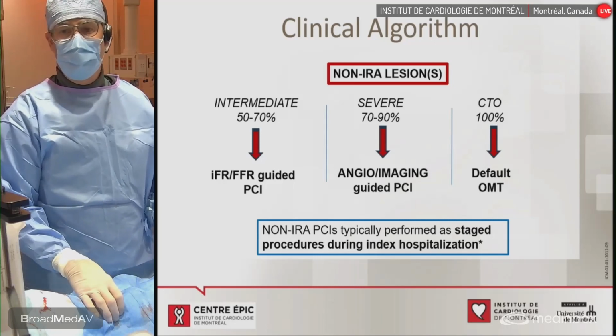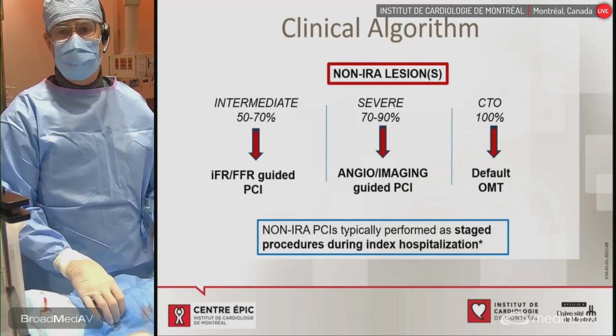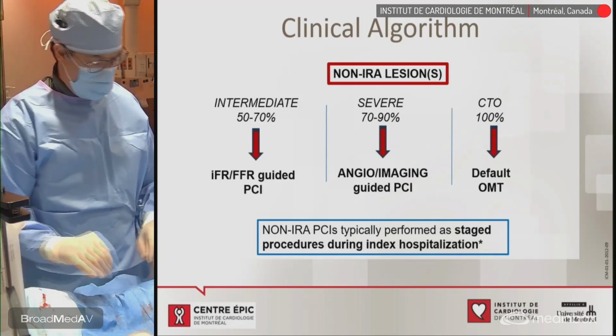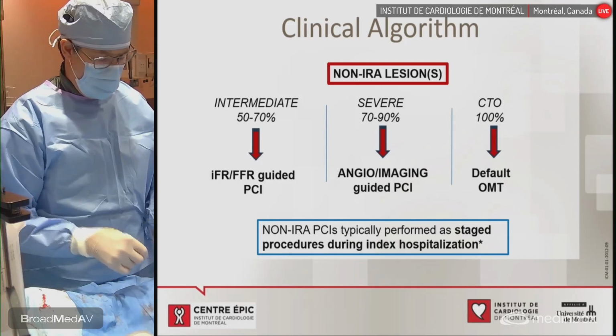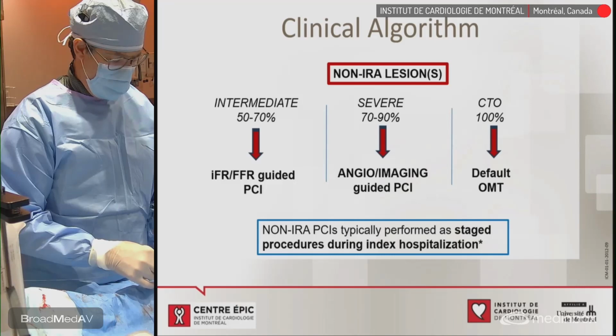So normally here at the Heart Institute, the non-infarct related artery are typically performed as a staged procedure during the index hospitalization. And this is the case for this patient. As I mentioned before, this patient came in with a STEMI about 2 days ago, so 48 hours ago. And now we're planning on doing an angioplasty. So may I have the next slide, please?